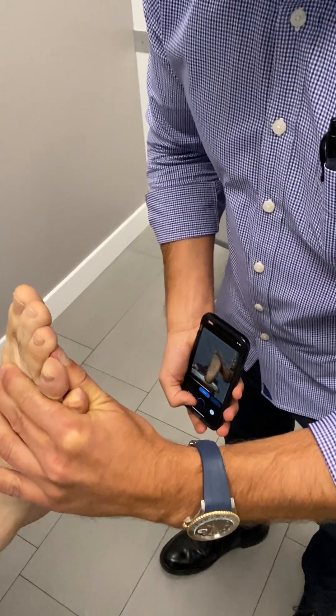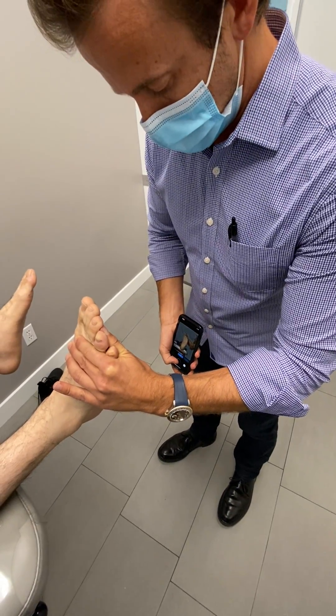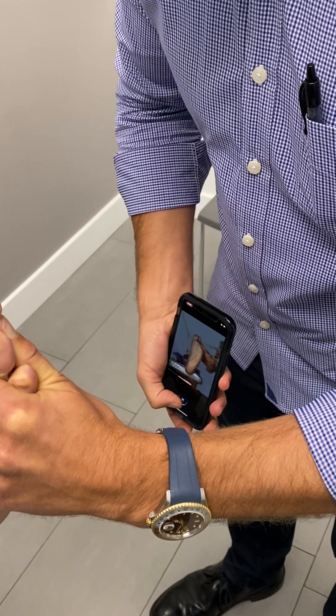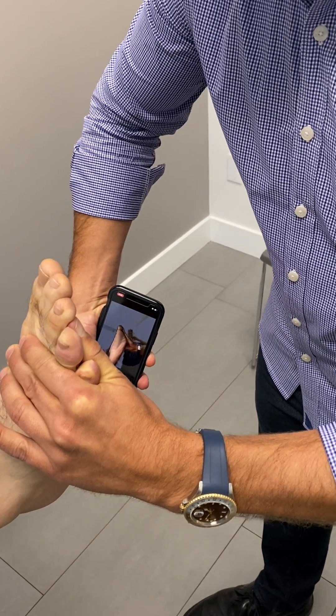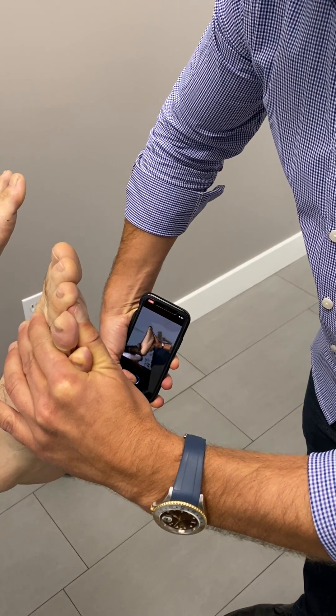I'm looking down at the phone like this. I'm just going to use my thumb and start scanning. I'm recording like a video — I'm going to go very slowly and get it all the way over here. See how it flashed red? That just means it was looking for a keyframe, so I slow it down.